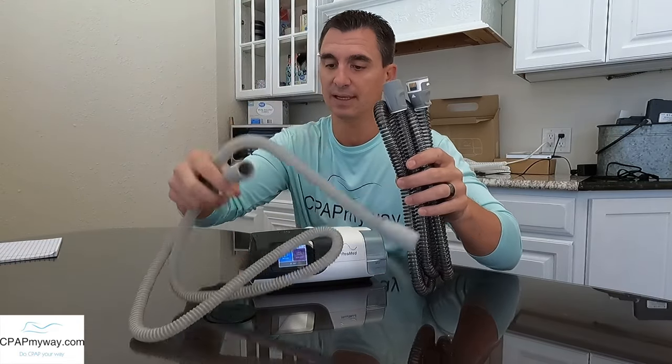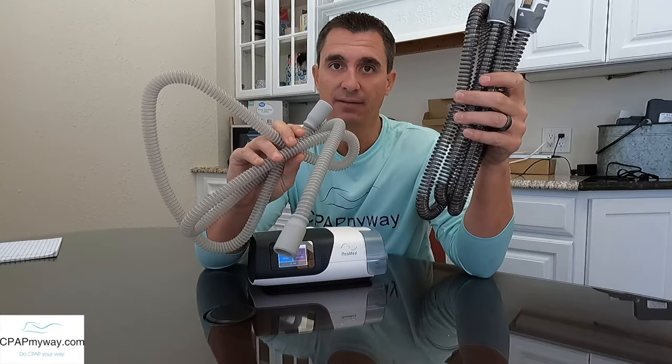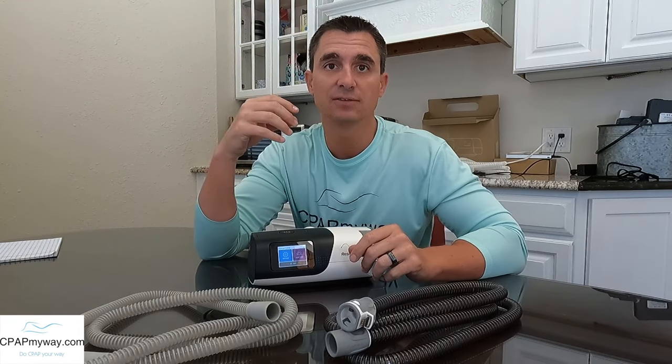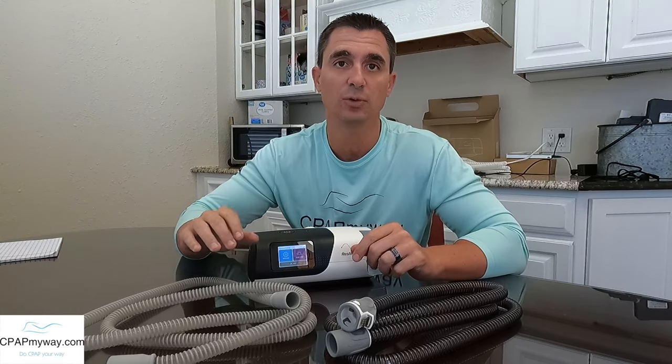So what are the downsides to a heated tube? First and foremost, I can tell you just holding these two that this heated tube is probably three or four times the weight of the slim tube. As you're moving around in bed, you're going to drag the heavier tube along with you. If you don't need it, it's just extra drag on your mask and it's going to cause some leaks because it's going to pull at the mask a little bit more than the standard tube would.